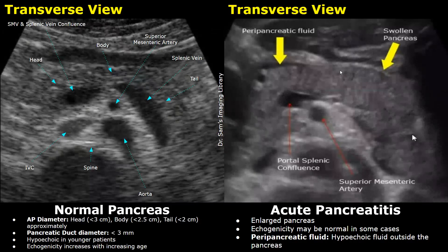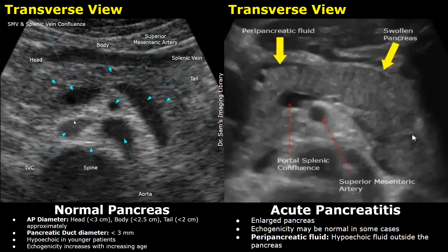This is a different image showing the normal pancreas in transverse plane — the pancreas does not appear enlarged. This round hypoechoic or anechoic structure is the superior mesenteric artery, seen behind the splenic vein. Posterior to the superior mesenteric artery is the aorta. These structures will be seen pulsating in a live ultrasound image. The IVC is seen adjacent to the aorta, and this hyperechoic structure with shadowing is the spine.